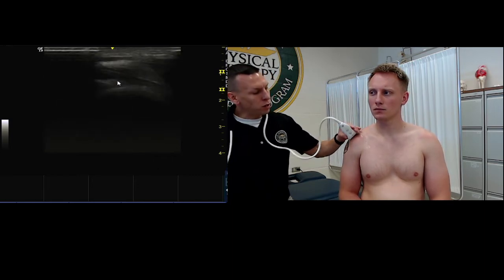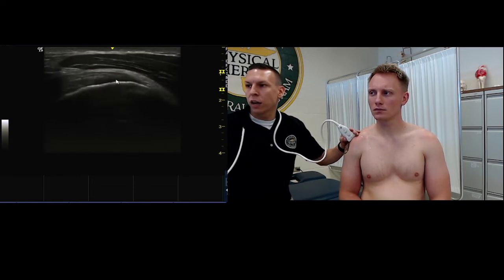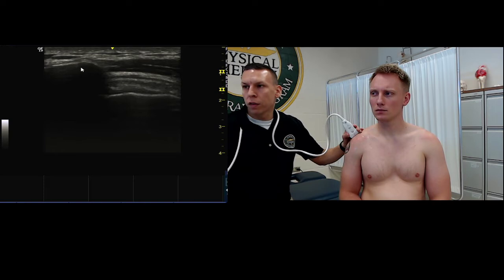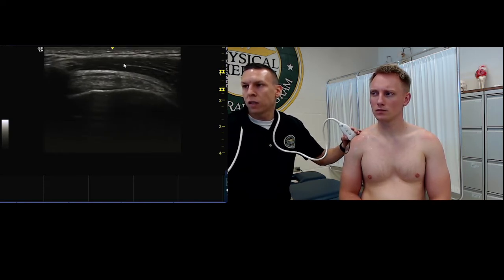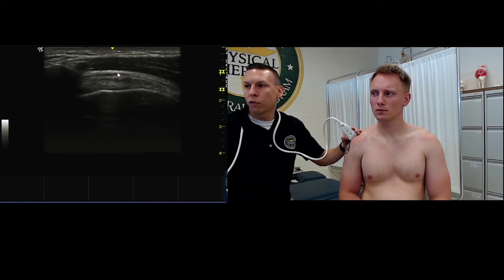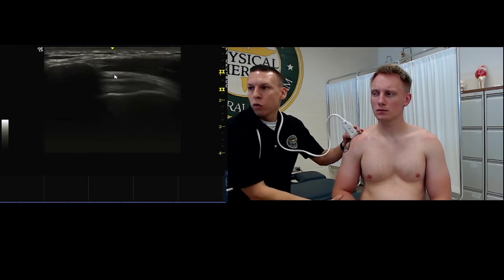And so this is the reason why we position them like that, because you can't really see the entire supraspinatus. So if you just take the probe and put it right over the lateral portion of the acromion, here we can find the deltoid. This is the supraspinatus. This little sliver, kind of hypoechoic, is the subacromial bursa or subdeltoid bursa, and we're looking for any kind of fluid in that structure. We can also move them into abduction.